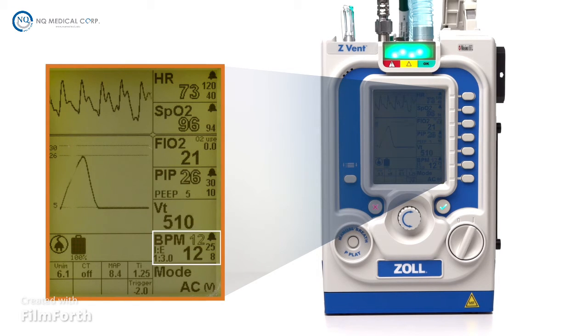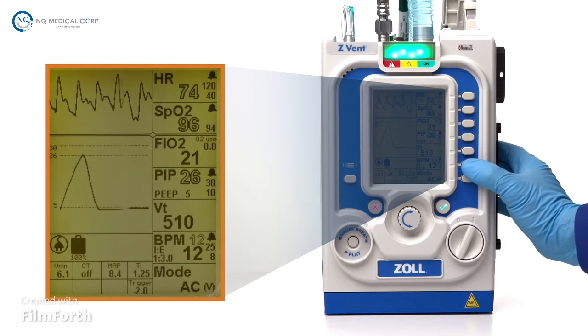The sixth window is breaths per minute, or BPM. In this window, the user can set the desired breaths per minute, the high breath rate and low breath rate alarms, and the I/E ratio, which is the ratio of how much of the breath is inspiration versus expiration. The BPM value can be changed from 1 to 80 breaths per minute.